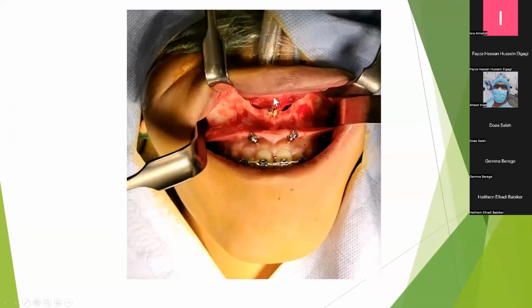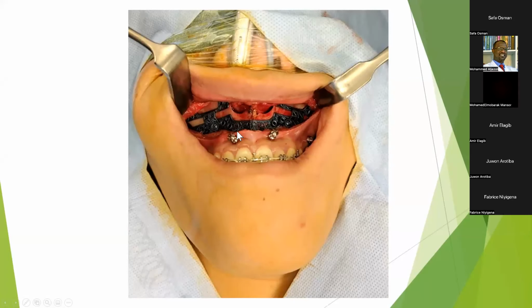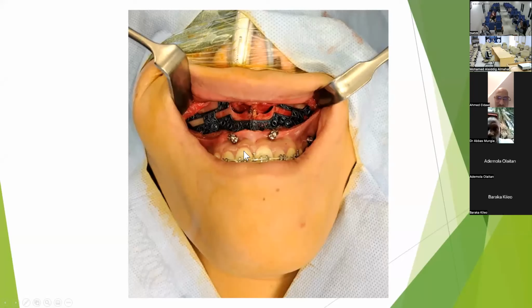And in the surgery, likewise, exposure, and this is what I was saying about the anterior nasal spine, very variable part of the operation where you may cut the spine off. I keep the spine intact, but remove it from the maxilla so the muscle attachments are attached. Placement of the virtual surgically planned cutting guide.